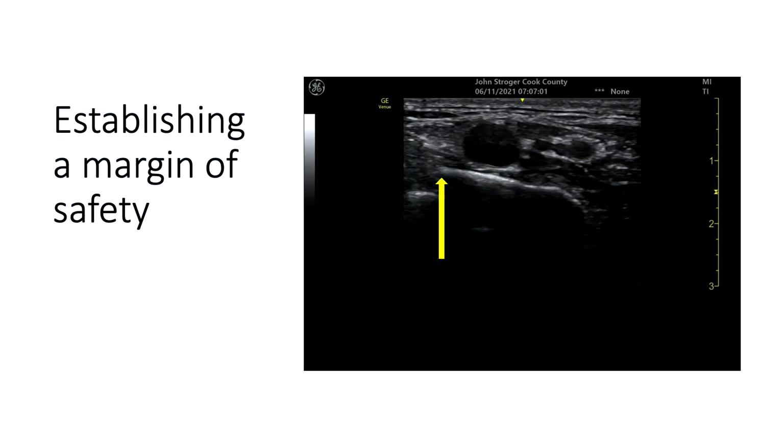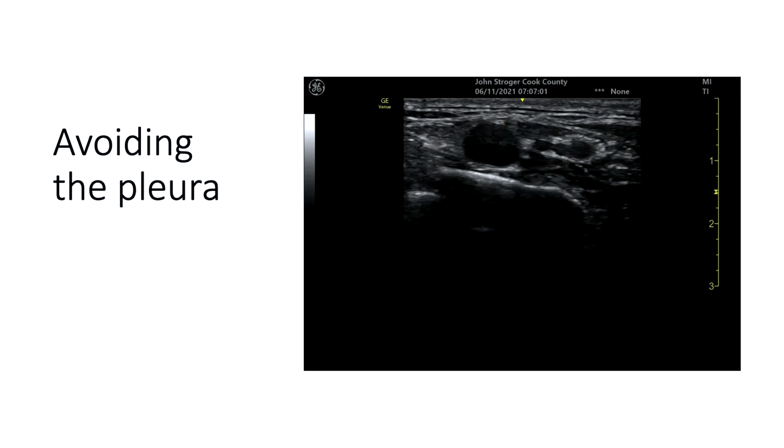Now, by putting it so far from your point of injection, you guarantee that if your needle drifted back, you will still be on solid ground. You still will be on the first rib. However, if you started with an image, so you see the rib will recede toward you, but you still would be very far from the edge, not in danger of falling over the edge.